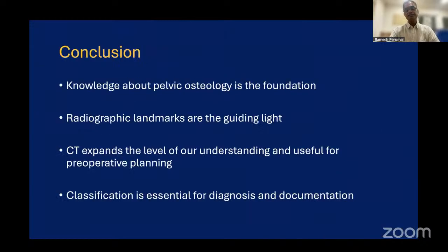To conclude, it is very essential to know about the pelvic osteology, which is the main foundation of our understanding of acetabular fractures. It is very, very important to see all the radiographic landmarks, which are a guiding light to diagnose these complex fractures. Once you read about the landmarks like the anterior iliopectineal line, the ilioischial line, the anterior wall, the posterior wall, the teardrop, and the roof of the acetabulum, all these landmarks will give us a guiding light to diagnose these fractures.